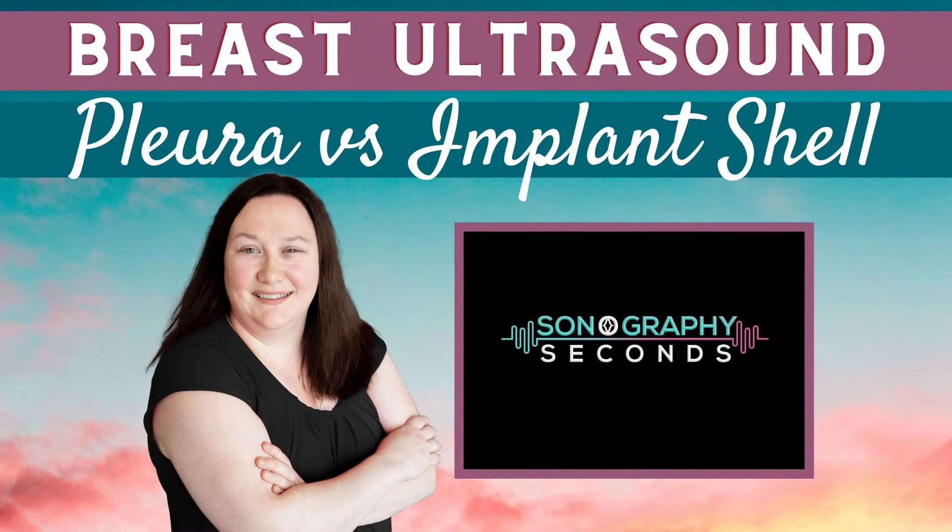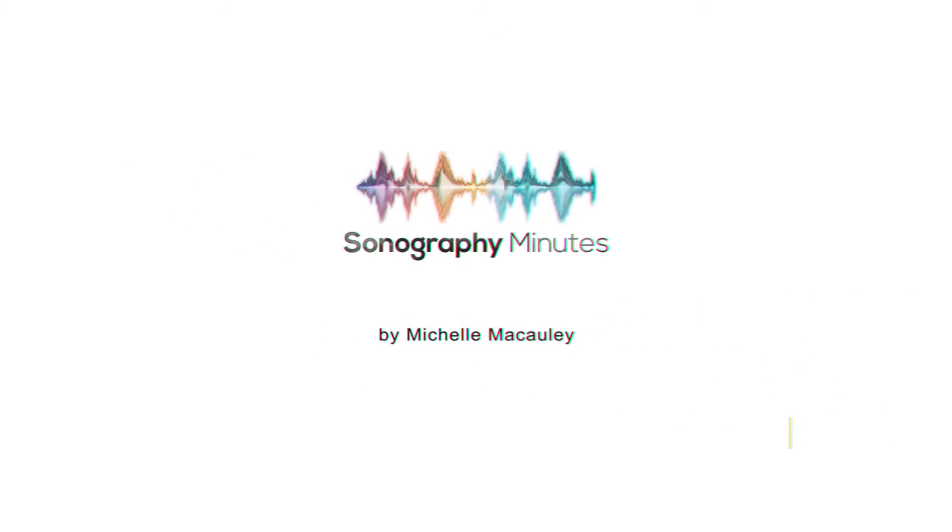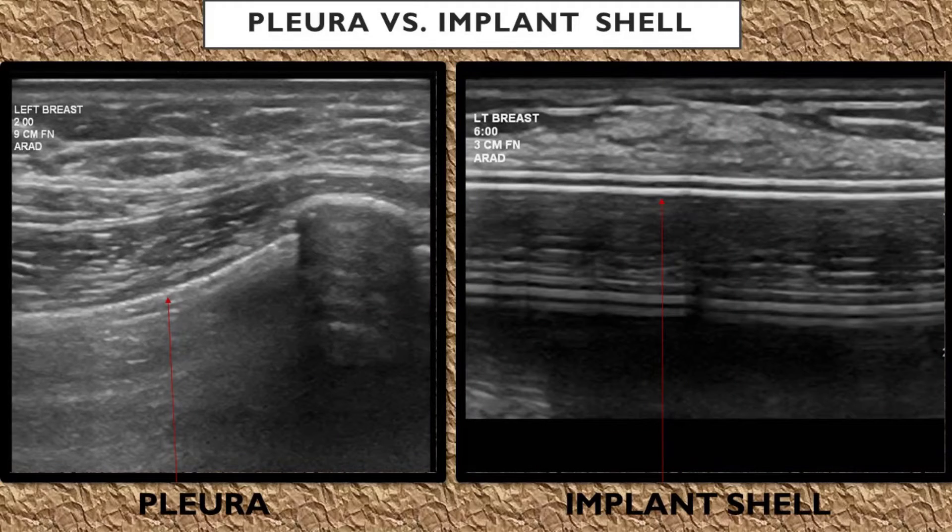On today's edition: pleura versus the implant shell. Let's talk about how to differentiate between the pleura with the lungs posterior to it, and an implant in the breast with an echogenic implant shell wall.